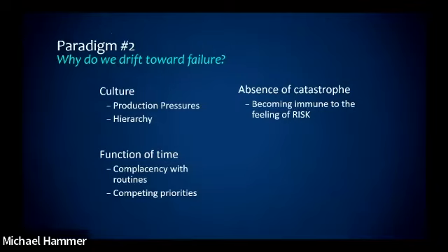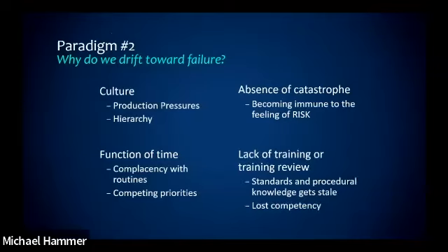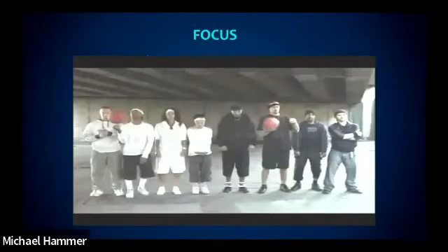There's an absence of a catastrophe, so nothing's gone wrong. So I feel pretty comfortable that we're doing okay. That's when something's going to happen. And then lack of training or training review. Standards, our knowledge just fades away. And we move towards complacency.